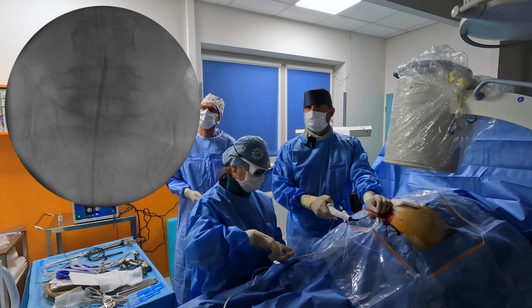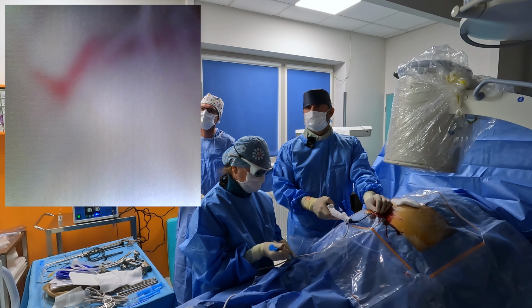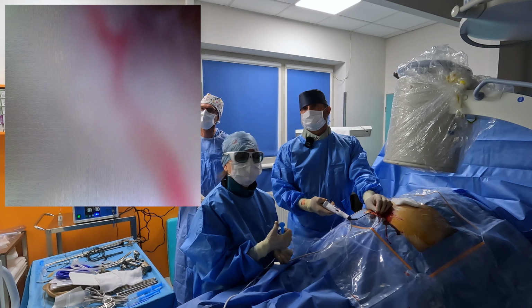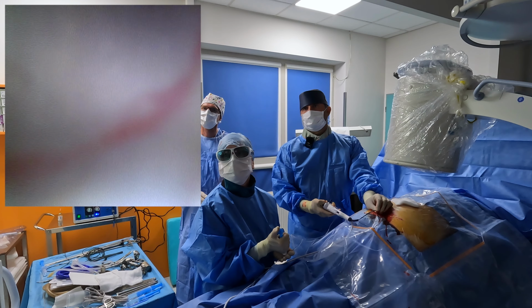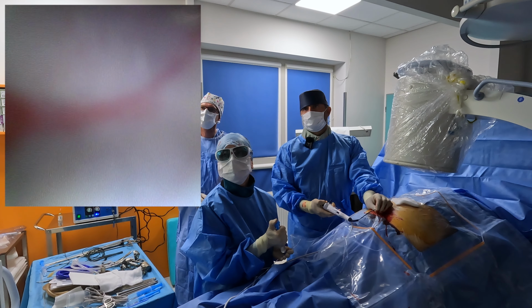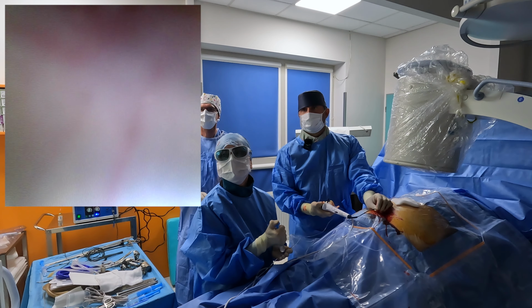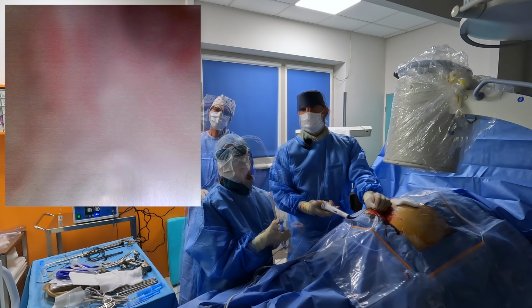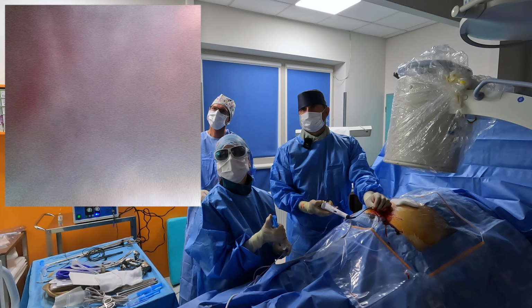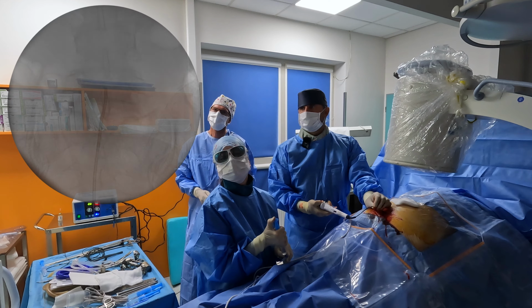lower down, and now we're getting the picture of disc level, but we are in posterior epidural space, so you don't see anything else except for the dural sac right now. You see the dura, which is nicely vascularized without any pathological changes. So we carry on, posterior epidural space, go down, and then I check where we are.